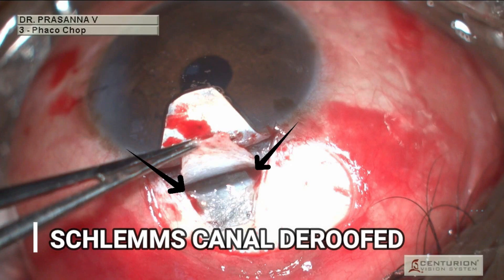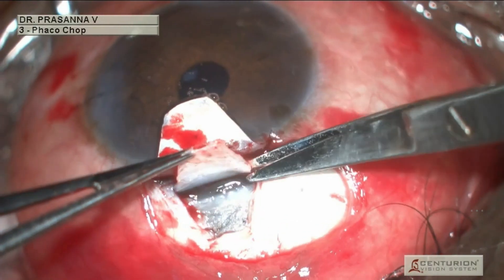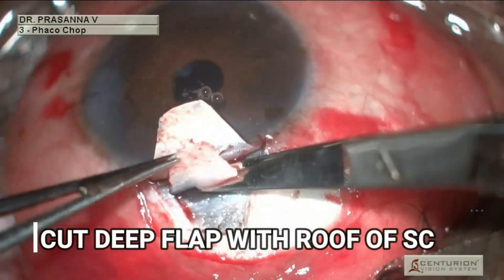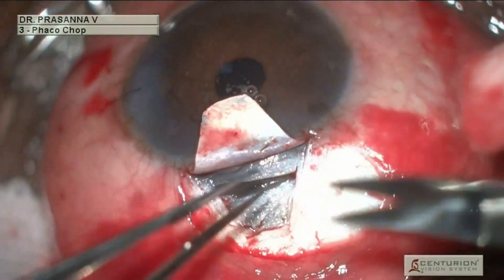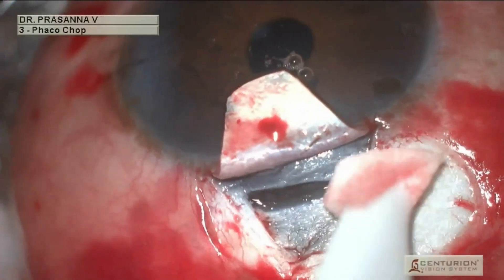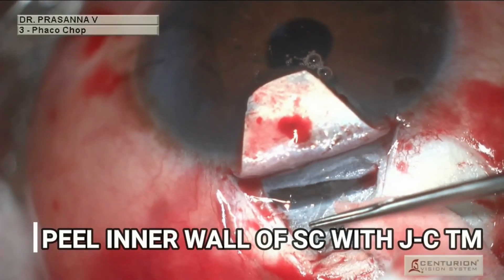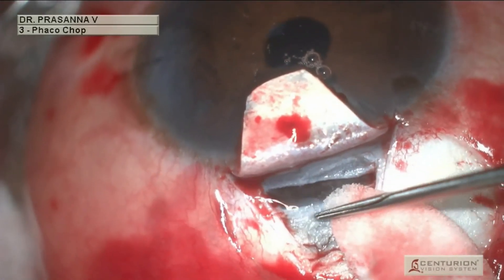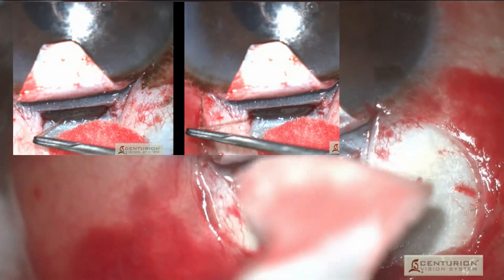The bleeding points indicate that Schlemm's Canal is de-roofed. Now comes the moment of truth where we peel the inner wall of Schlemm's Canal. Note the excellent filtration.